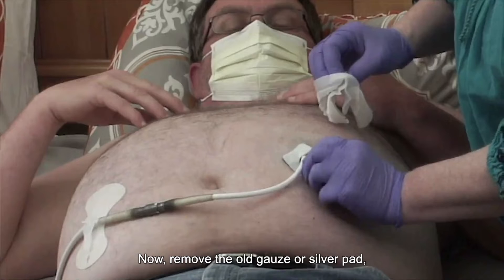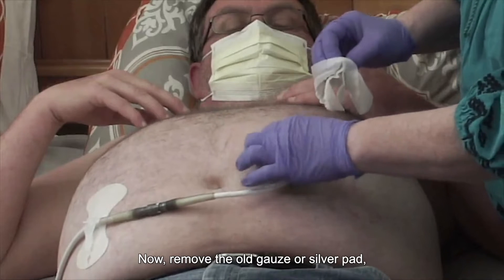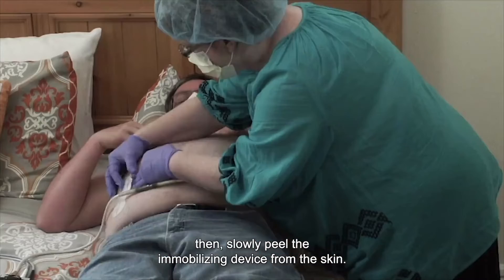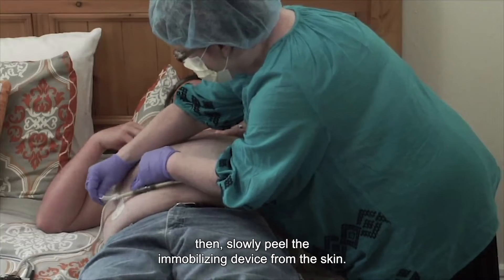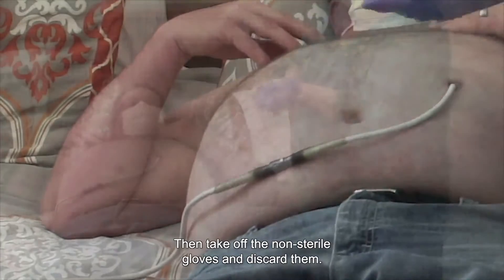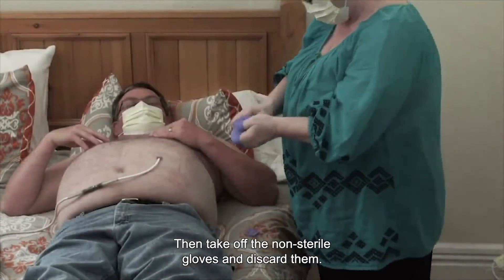Remove the old gauze or silver pad, then slowly peel the immobilizing device from the skin. Then take off the non-sterile gloves and discard them.